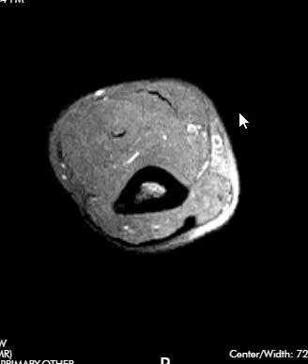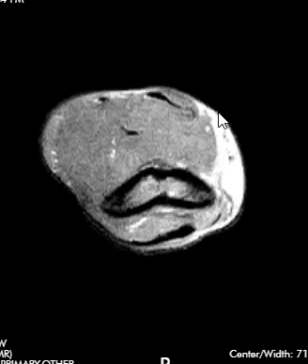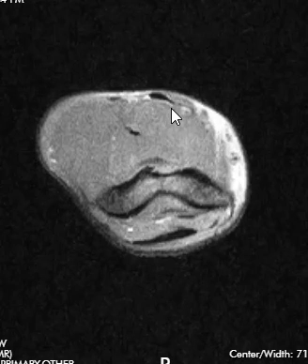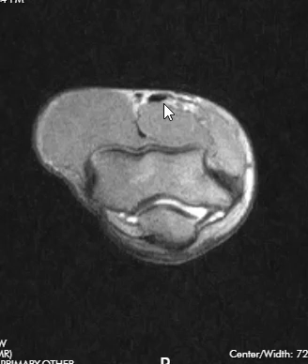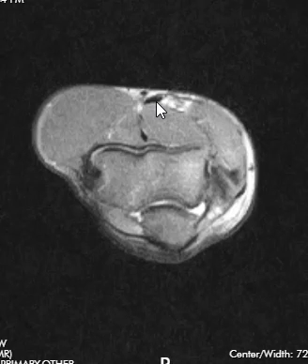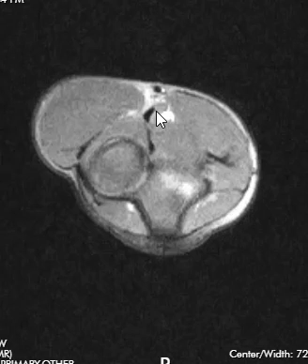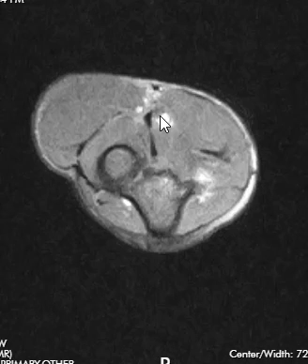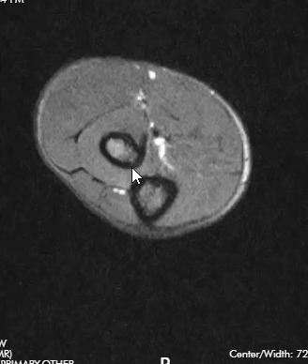If we go down, we'll see the muscle completely disappear and all we're left with is this little tendon — the biceps tendon. We watch that come down as we get close to the elbow joint, and then below the elbow joint we watch carefully as it finally attaches on the radial tuberosity, which is well below the elbow joint.